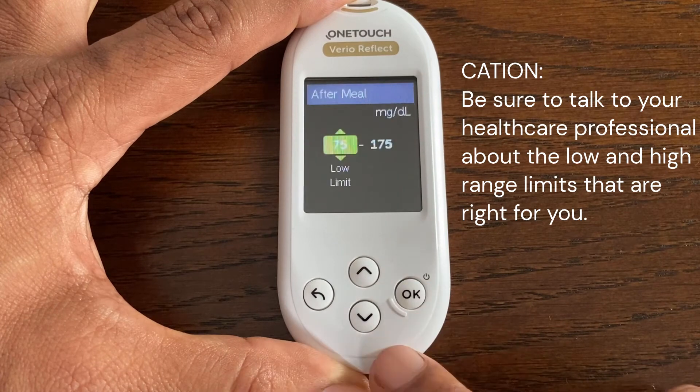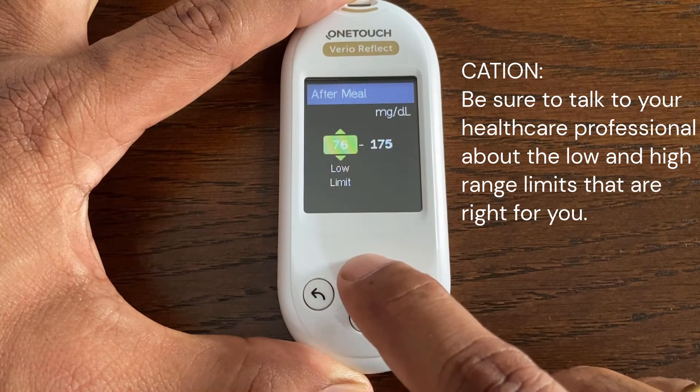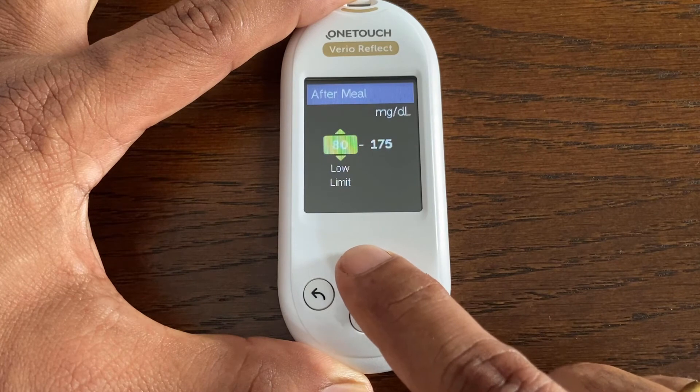In a similar way you can change the range limits for After Meal — edit the preset low range limit and the preset high range limit.